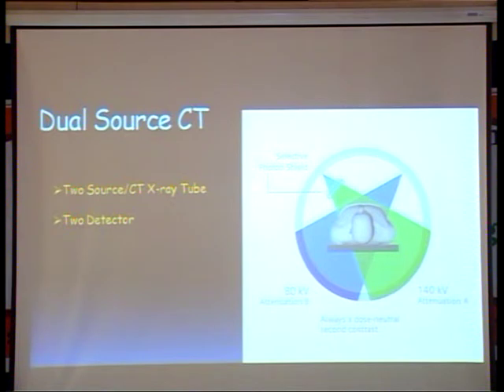Now, this is the latest advancement: dual source CT. Presently this technology is only with Siemens. Netra, correct me if I'm wrong. This technology is only with them, since he was in Germany last month, he knows this. So, dual source CT.